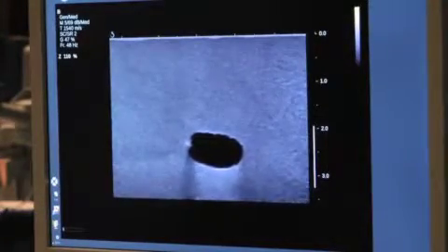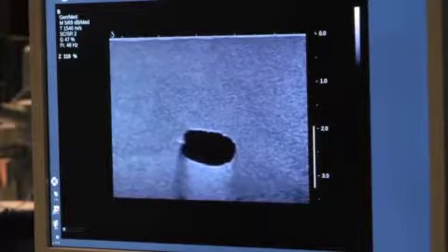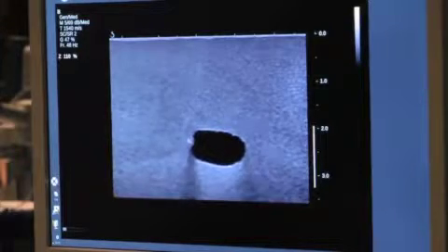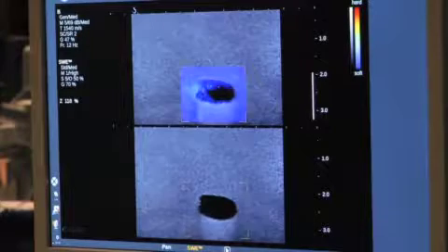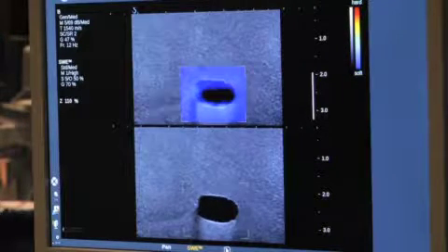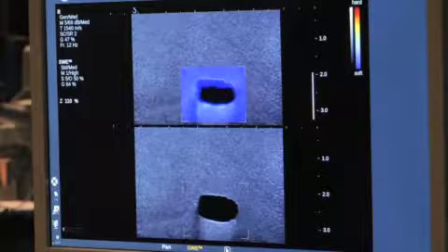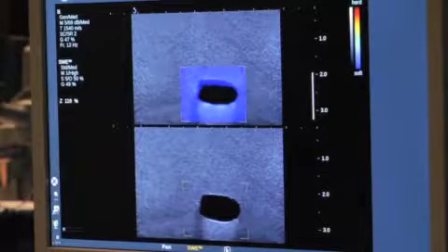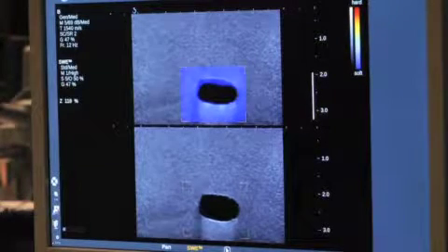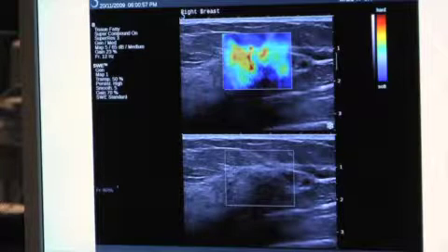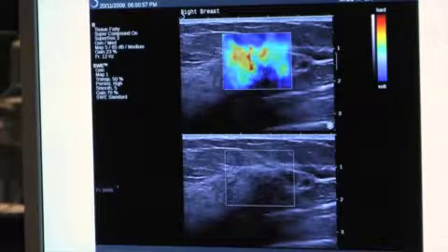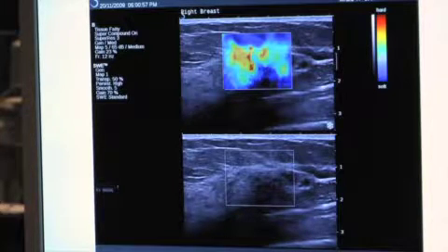In contrast to solid lesions, I will demonstrate a cystic lesion — a lesion with a fluid component. Anything that is liquid or fluid with a low viscosity will not produce a shear wave. When I enter the shear wave mode and bring my box down to the cyst, I see that the cyst is clear, which validates that this is indeed a lesion with a fluid component. Shear wave elastography provides additional information to the clinician, as in this case of invasive lobular carcinoma which was not detected on mammography.